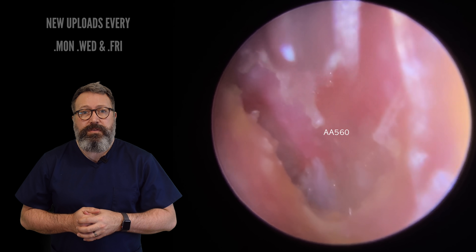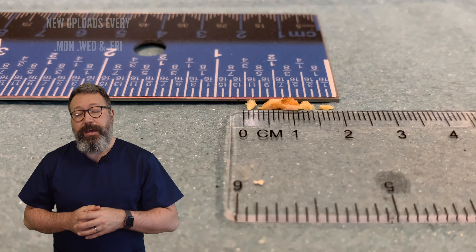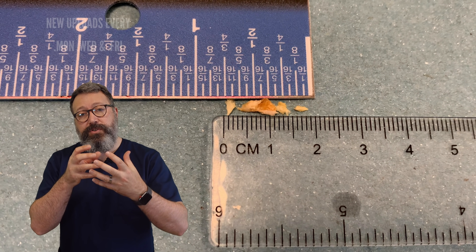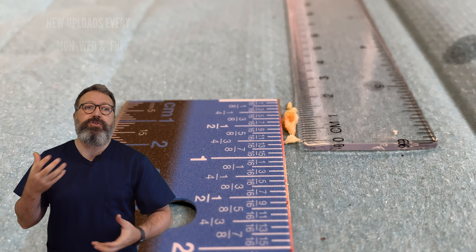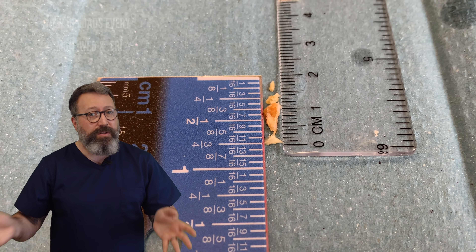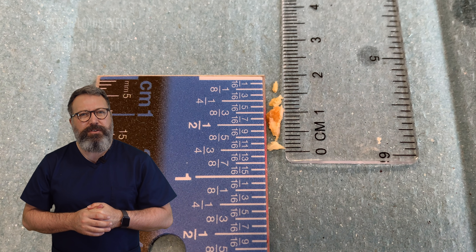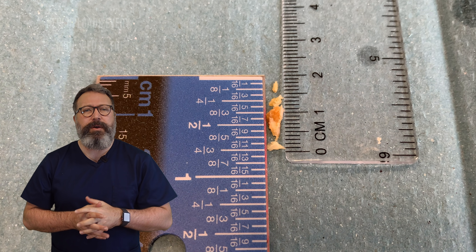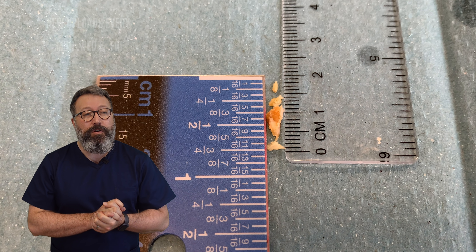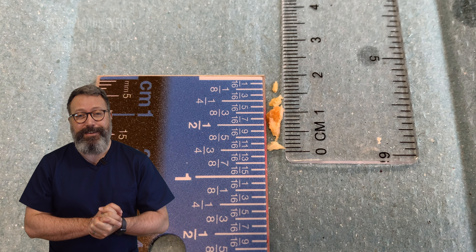All that's come away. Now we can just about make out the features of the eardrum there. It doesn't look like a tremendous amount, but it was so deep and actually attached to the eardrum that it was causing so many issues. The patient could hear so much better — the difference from when they walk in to when they walk away is massive. We've taken away about a centimetre and a half, three quarters of an inch. I hope you enjoyed that video as much as I did voicing it over. We shall see you again on Friday — take care of yourselves, take care of your ears, and take care of one another. Bye everyone.